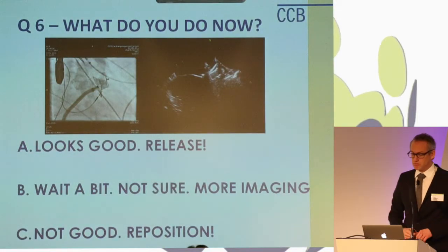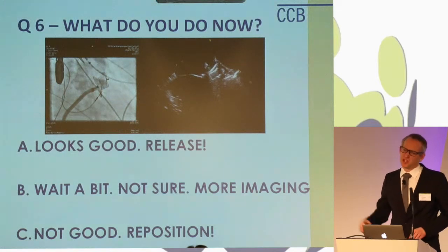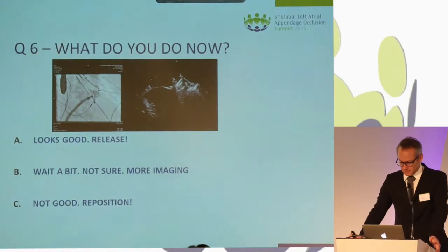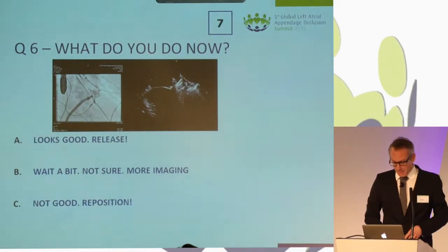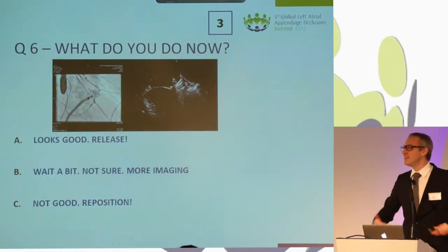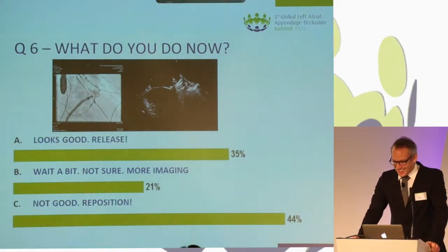So what would you do now? Looks good, wait a bit and image more, or would you reposition one more time? I know it might be difficult. You want to have more images now and run TEs and more fluoro, but that's life.